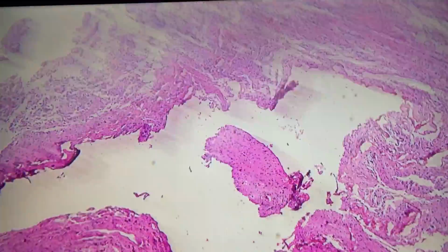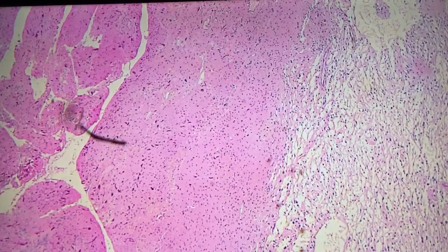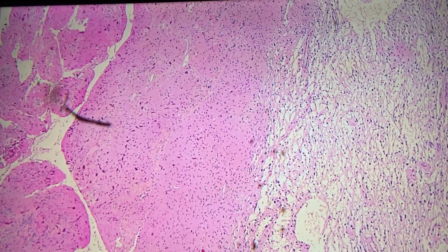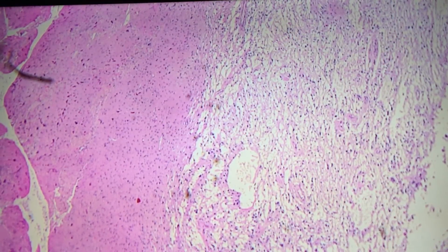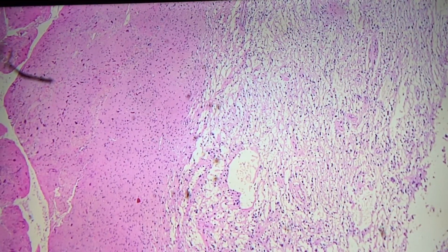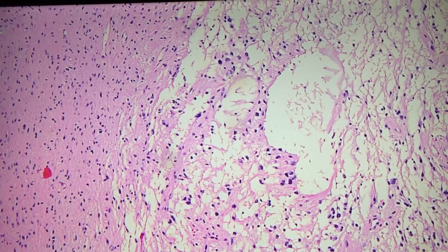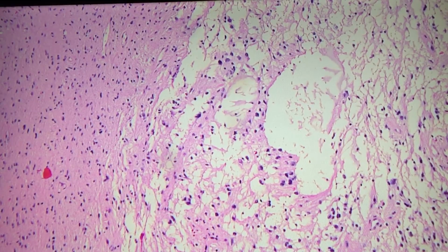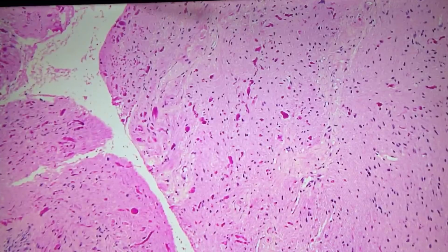Okay. Low-mag. This is good. The same kind of biphasic look. We have areas that look dense, the other areas look loose, microcystic. The nuclei for the most part are small, bland looking. I thought I saw some cells that look larger or more hyperchromatic, especially in the dense areas. Can I show the dense area first?